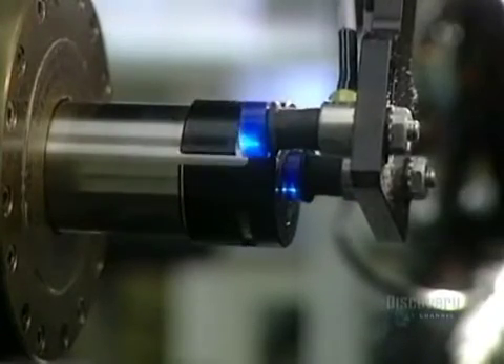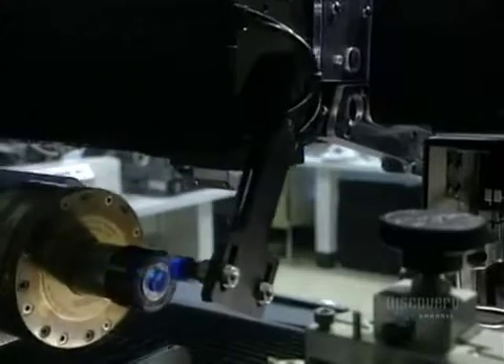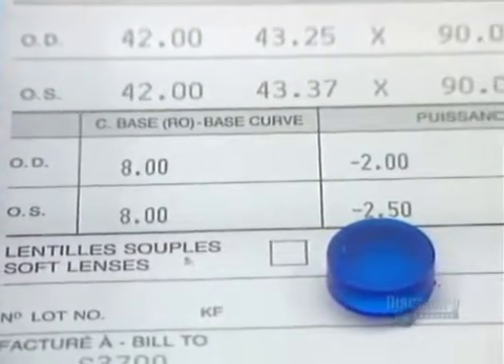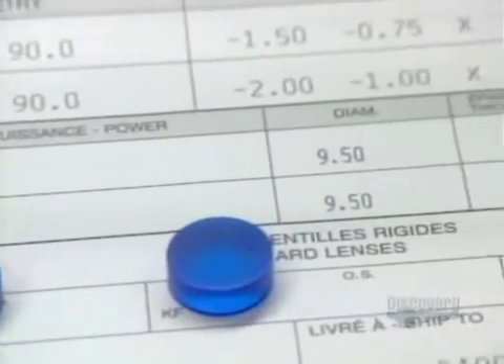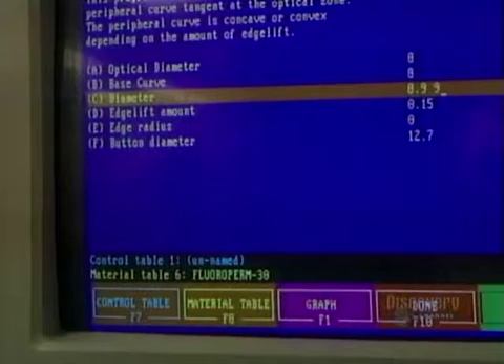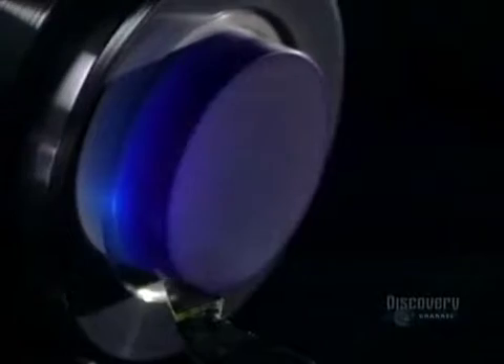These small polyHEMA discs are used to make soft polymer contact lenses in a variety of colors. We see here a patient's prescription, essential to the fabrication of lenses. The process begins with data processing control of the shaping — data is supplied by computer, which controls a digital lathe.